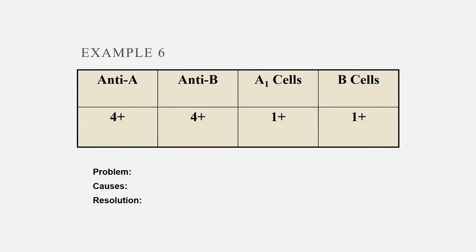Because they should have A and B donors on their shelves at all times, and they should have anti-M antisera that they can type those donors for, prove they're negative, and then use them. But if they don't have an SOP for that procedure, then yes, they would send it out. Most hospital labs will send out ABO discrepancies, unless you're like Shands. Shands pretty much does everything on their own, except platelet stuff.